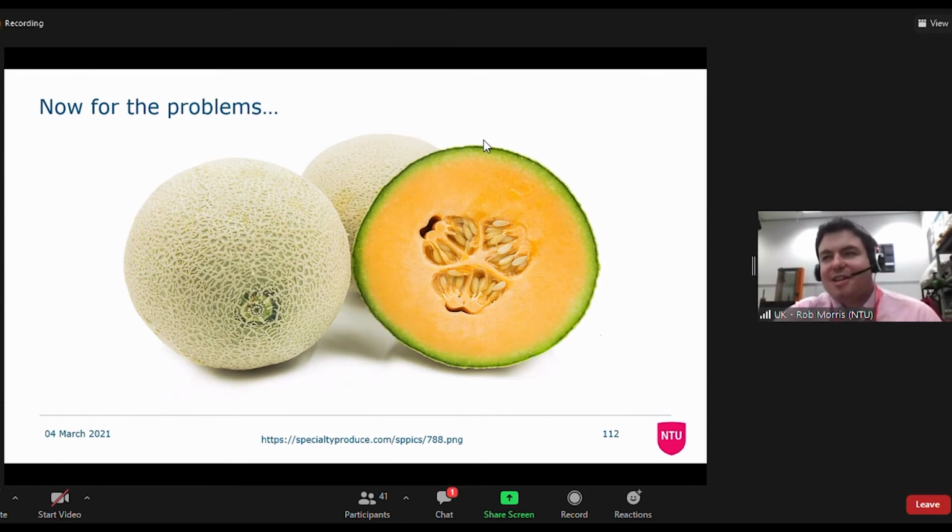I just want to touch now on the reason why MRI is a nuisance. So this is a cantaloupe melon, and this represents about the largest thing that exists on Earth before you start to re-radiate radio stations from your body. If I stuck a melon in the MRI scanner, all is well. If I stick a watermelon in the MRI scanner, I'm going to start to pick up the radio on the MRI scanner. It's not so bad on this one at 63 megahertz.